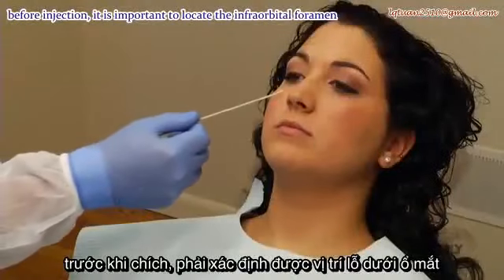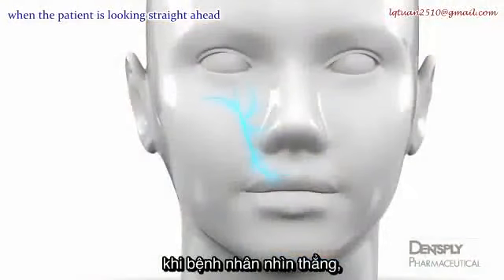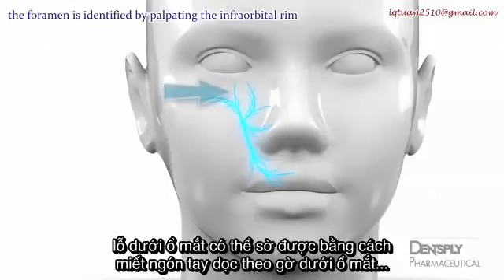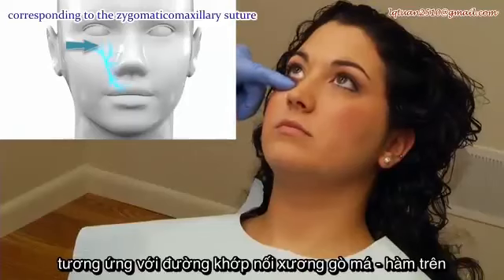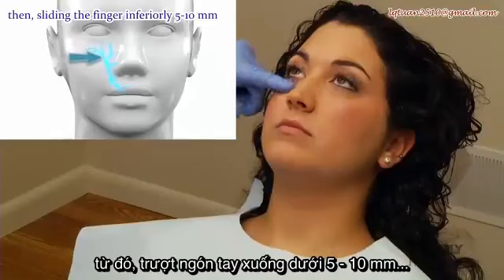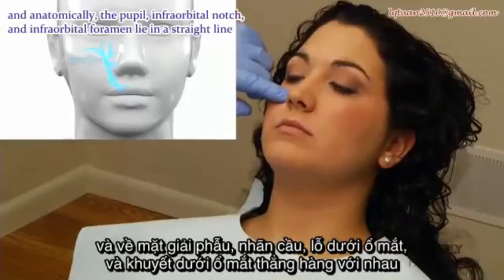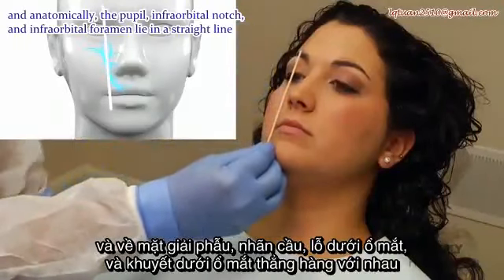Before injection, it is important to locate the infraorbital foramen. When the patient is looking straight ahead, a line drawn vertically from the medial aspect of the pupil will overlay the foramen. The foramen is identified by palpating the infraorbital rim and feeling a notch or roughness corresponding to the zygomaticomaxillary suture. Then, sliding the finger inferiorly 5 to 10 millimeters will bring it to rest in a depression containing the infraorbital foramen. Anatomically, the pupil, infraorbital notch, and infraorbital foramen lie in a straight line.